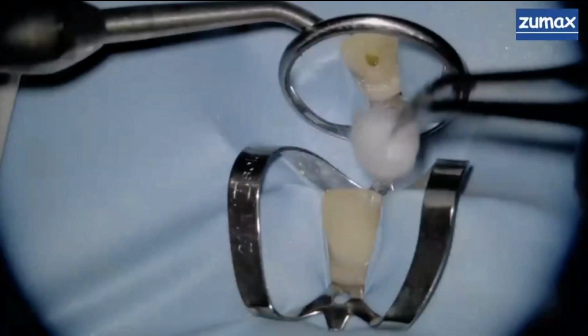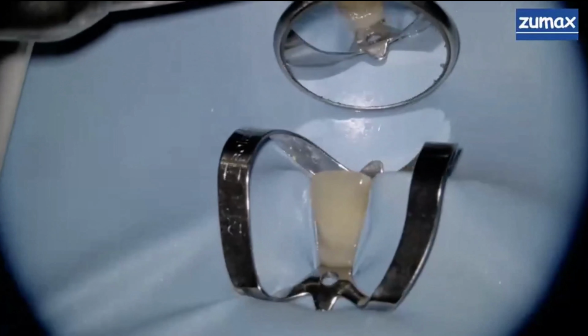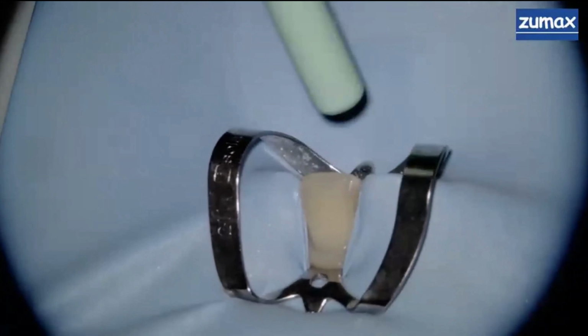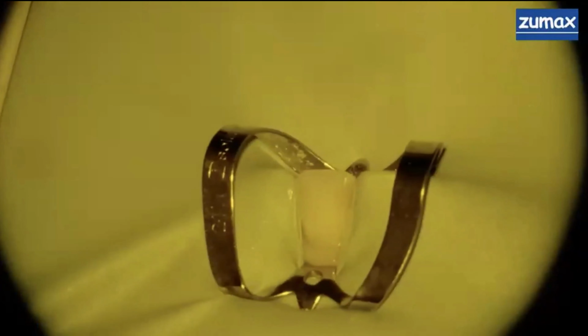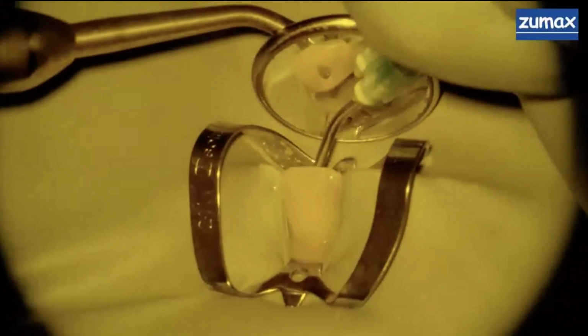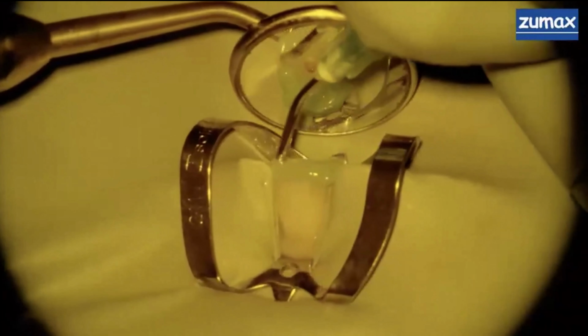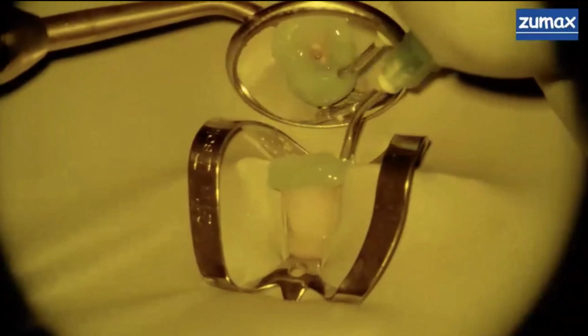Then there's the anterior tooth. Just like the premolar, the anterior tooth has a small access. So I have an example here of an anterior tooth. You can see the access cavity, the same principle. In this case, what we want to do is extend that access cavity coronally and make it larger with Sound Seal. So I'm putting a little bit of bond on the anterior tooth. It'll help adhere that platform build better. And I'm extending the cingulum out with Sound Seal. I'm making a donut all around this tooth.